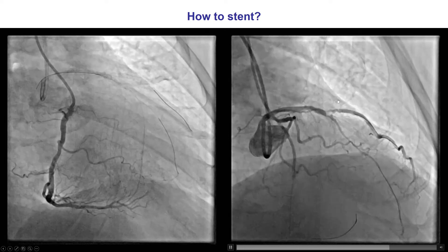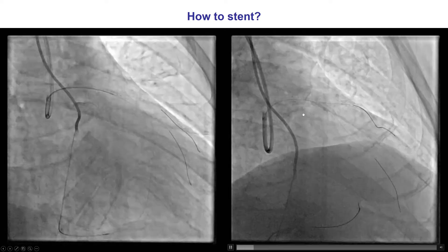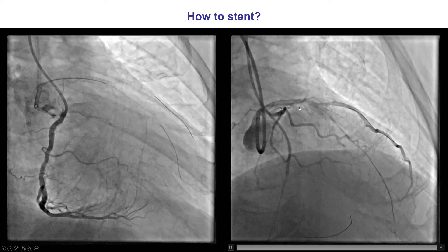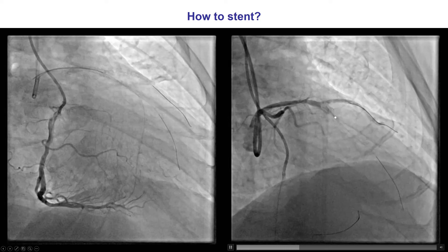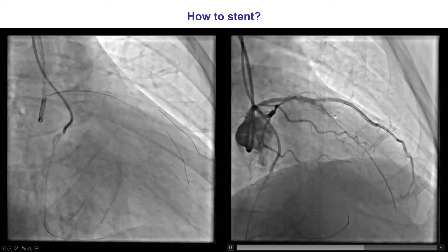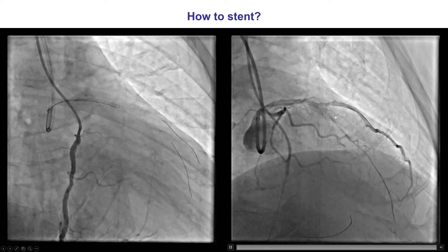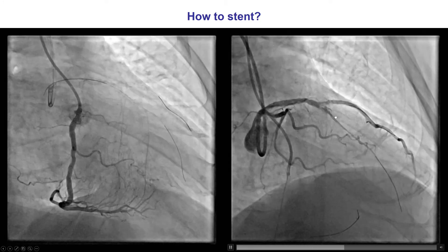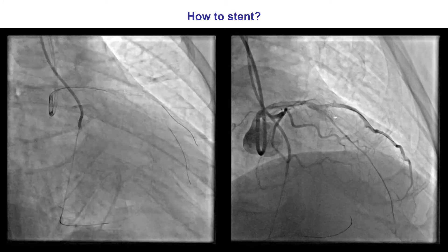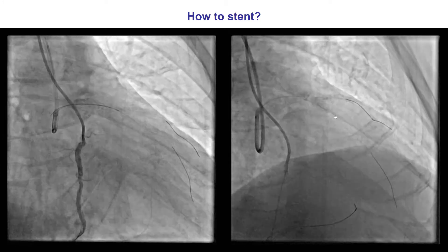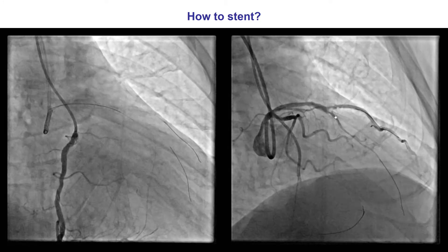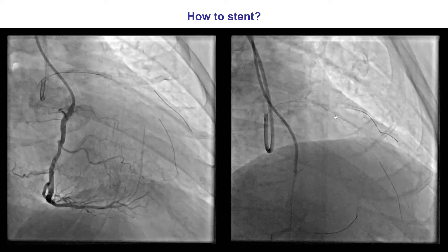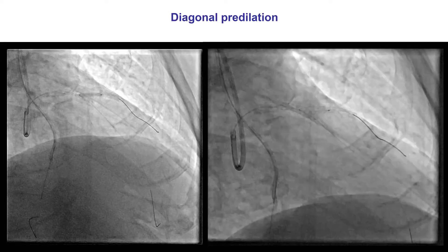The idea was to use two stents to ensure that the diagonal maintained patency and that the LAD had a nice result. The best technique for that — for both left main and non-left main bifurcations — is the DK crush technique.